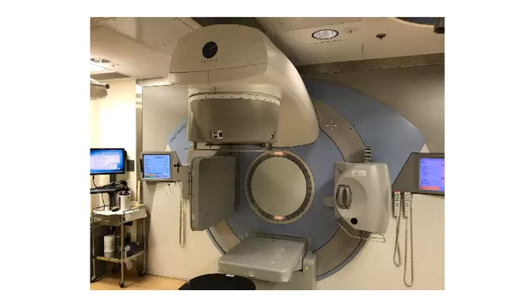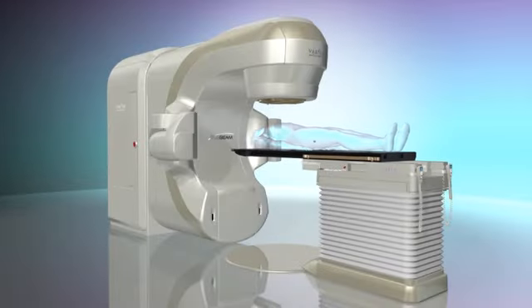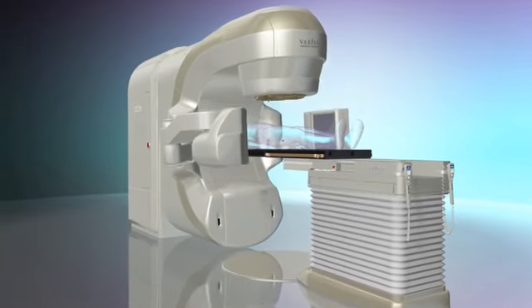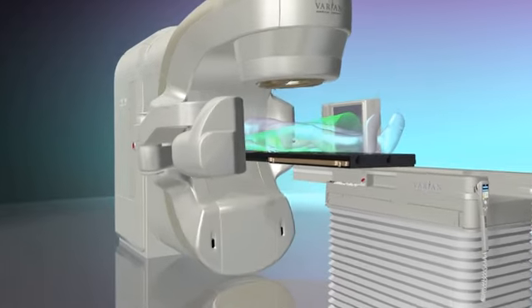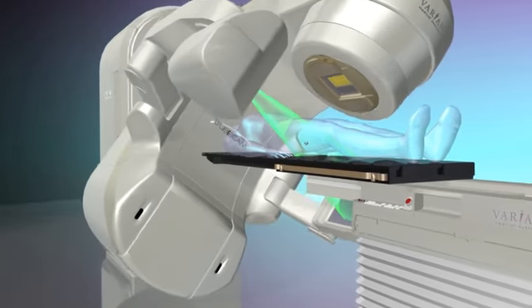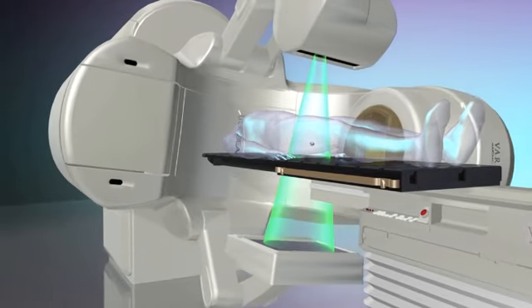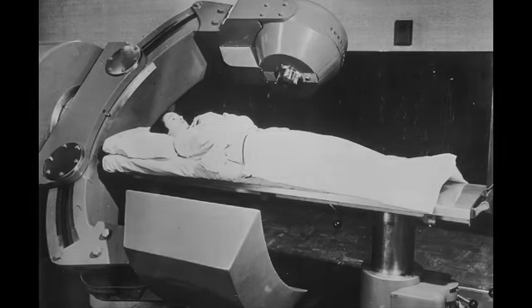So I'm going to start by talking about linac systems that are in a C-arm configuration. You've seen one like this already in the previous video, so this should be somewhat familiar. The systems are quite advanced. The gantry rotates around, as we saw last time. This system you're seeing here is in imaging mode right now. This is the imaging system taking a CT image that can provide very precise alignment. So it's very advanced, but let's look back a bit at the history of this.